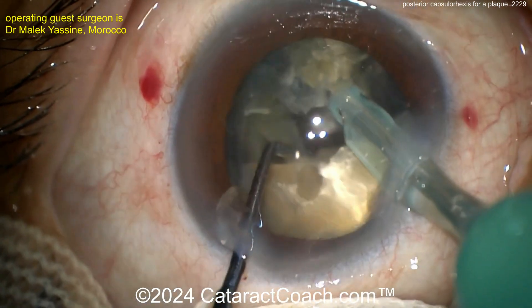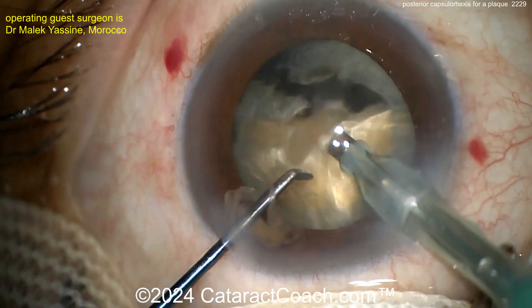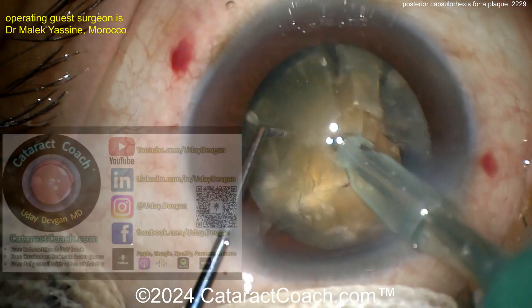Something very satisfying about watching a well-done FACO chop. This surgeon has really mastered the technique of FACO chop — really very controlled. We're not worried about the speed, we're worried about the control. The control here is great.